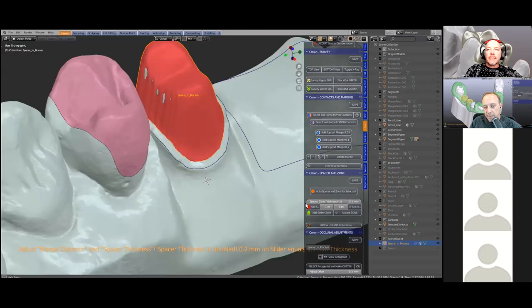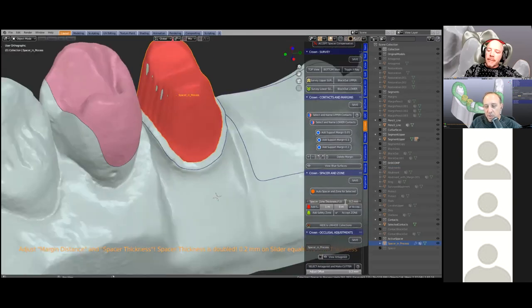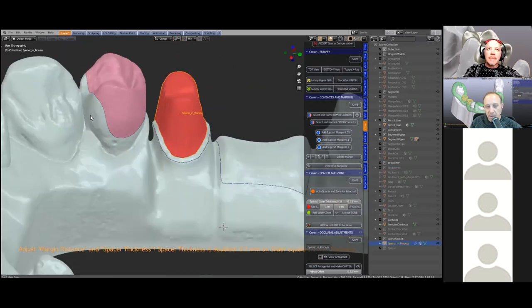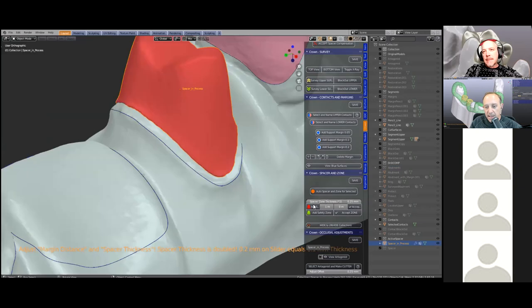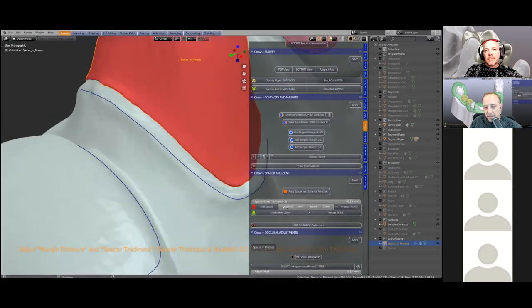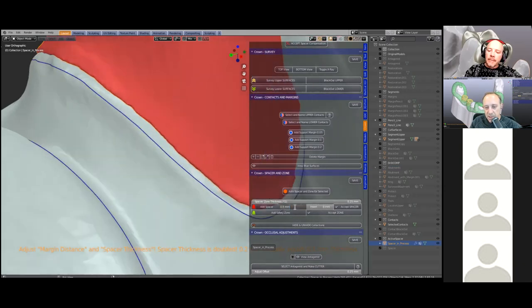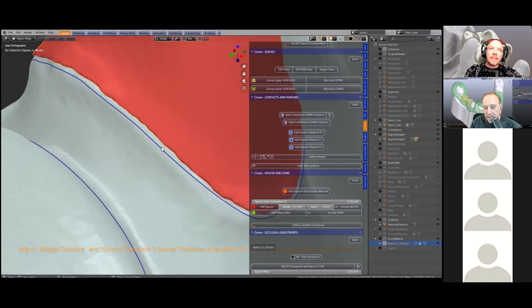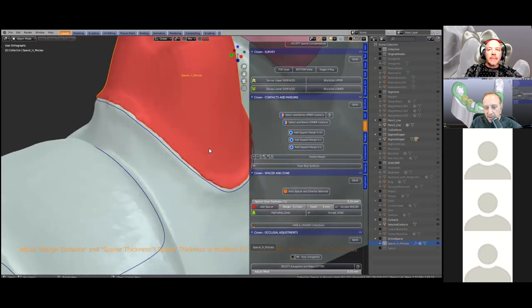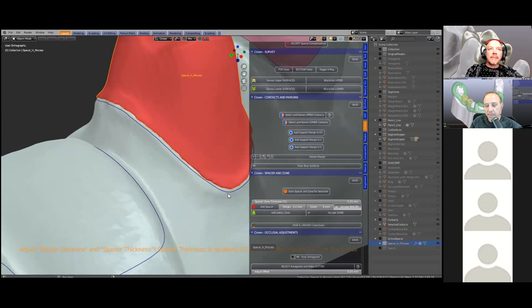The procedure follows normal laboratory procedure — you've got the model, you're trimming it, putting die spacer on. The die spacer can be set; by default it is 50 microns but you can set it to whatever you like. There's also a distance between the pencil line margin and the die spacer that can be set — you can pull it away from or towards the pencil line, and it can also be inverted.